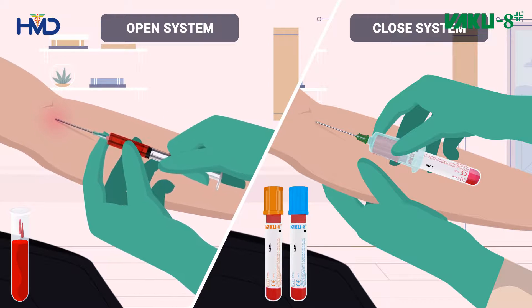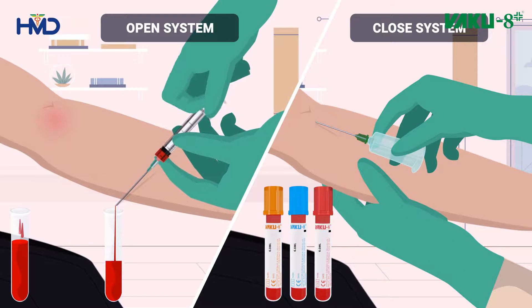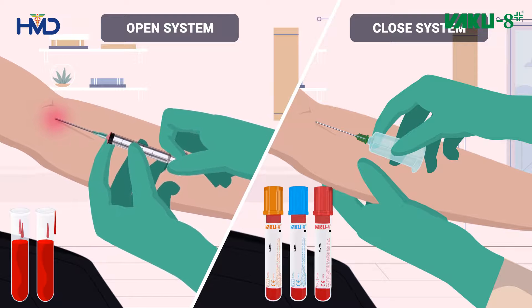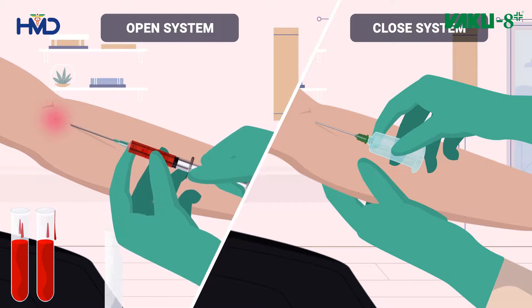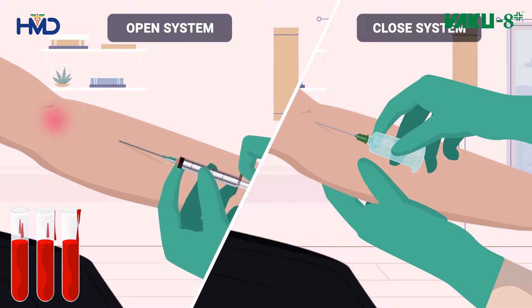Usage of blood collection tubes protects the patient from hemolysis, wounds, and trauma caused by multiple pricks. It also ensures a closed system instead of an open system by avoiding blood exposure from spilling and possible splashing due to blood being transferred from syringes to test tubes, which may lead to inaccurate results.